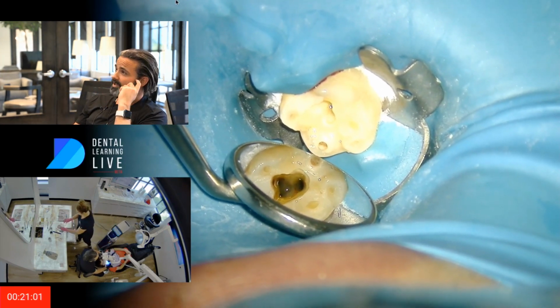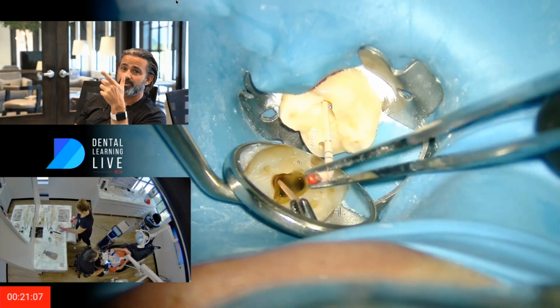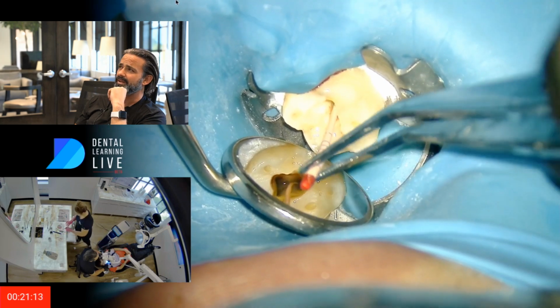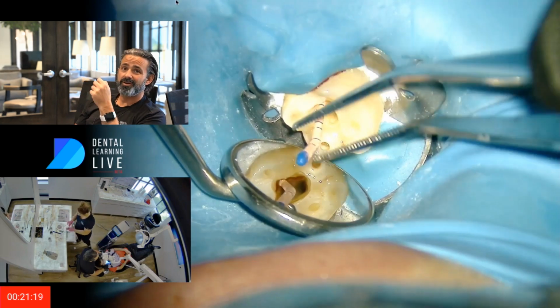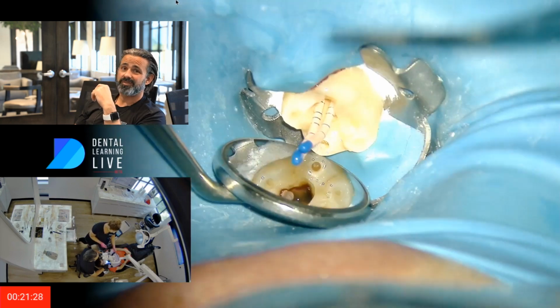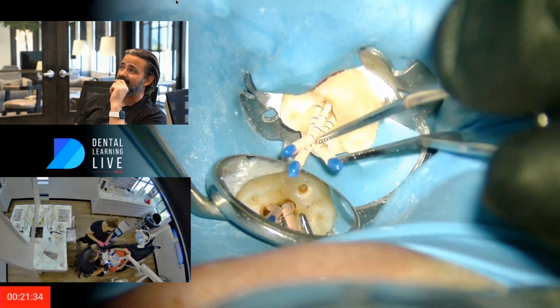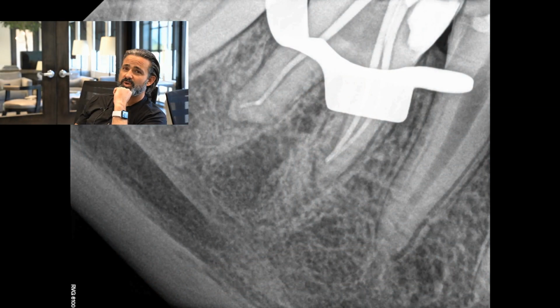And I'm going to get a close-up on that. When I'm irrigating post-GentleWave, there's a lot of things you can do, but my preference is to use 3% hypertonic saline. It works really well for me. It's not a chemical reaction. It's not chemical cautery going on at the apices. It's just causing natural clotting, and by the way, blood clots float in saline, so the more saline, the easier it is to float a blood clot up. I like that concept. But because I did not establish patency and I didn't do a true length other than measuring on a cone beam, I want you to see what those 30 cones look like on an Xray right then and there.